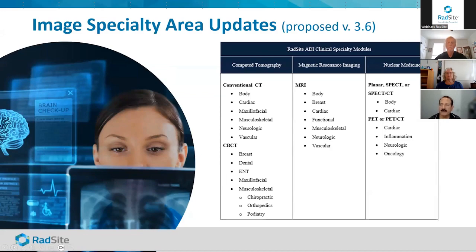And so what I would really like to see as the head of the standards committee is for cone beam CT to have more of a homogeneous mechanism for measuring radiation dose, because claims for cone beam CT are pretty wide and broad, and there's not really a standard the same way there is in conventional CT. And also for image quality, I really would like to be able to compare one cone beam system versus another, which is more difficult to do than with conventional CT. And I'd like to compare cone beam with conventional.